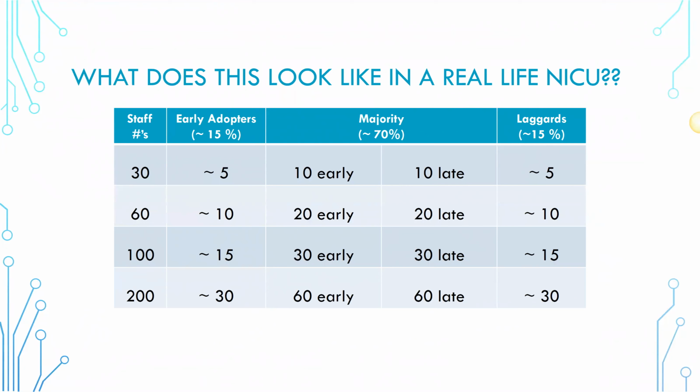So who's going to look at the tracings, making sure that you have good, stable quality? Who's going to interpret the tracings? So looking at the tracings and kind of trending them, I think that's the bedside nurse's job. But interpretation and decision making, that runs to the medical team.